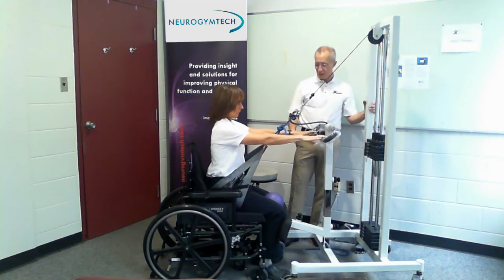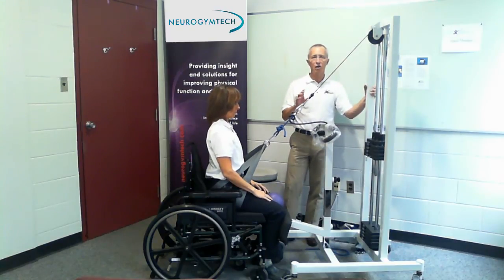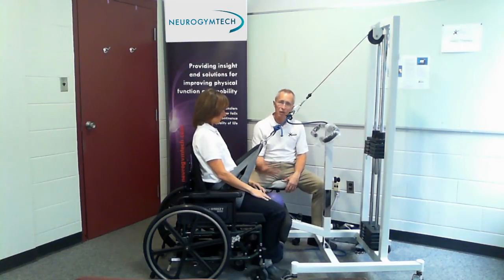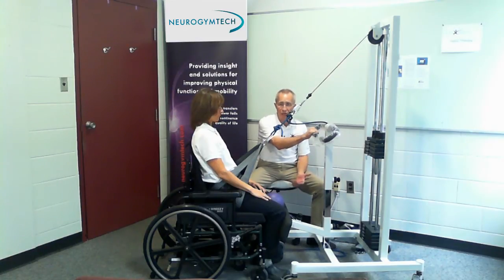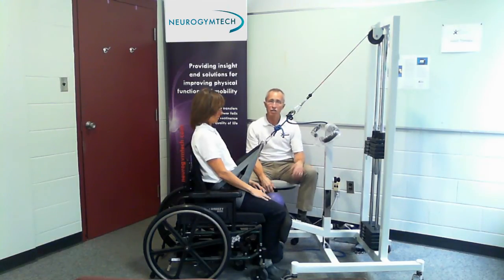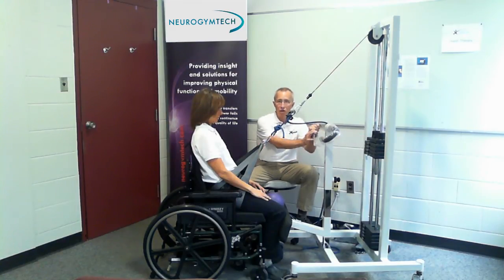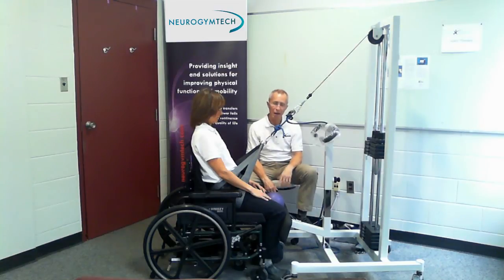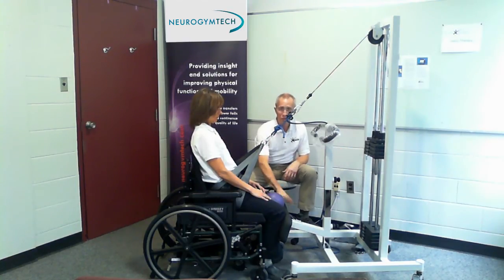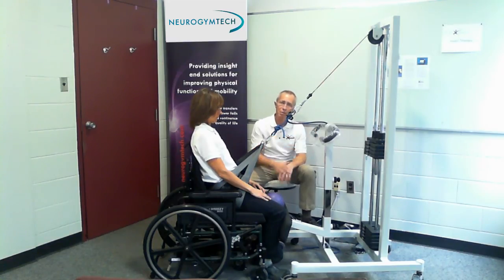We're trying to create a situation where she can stand regardless. There are three things helping a patient here: she's pinned at the knees so catapulting over the knees assists, there are arms to pull on, and there are also weights. Clinically you can take away or reduce any of those. As she gets stronger, we reduce the weights, or you saw her doing it without hands, or we could take away the knee pad. But remember — the whole premise is functional and intense training. We take her all the way to function regardless of what that takes. A great example is that woman who was 620 pounds who hadn't stood in four years — she could execute a squat but needed 80 pounds of counterbalance, the knee pads, and had to pull. But she was able to execute that function.